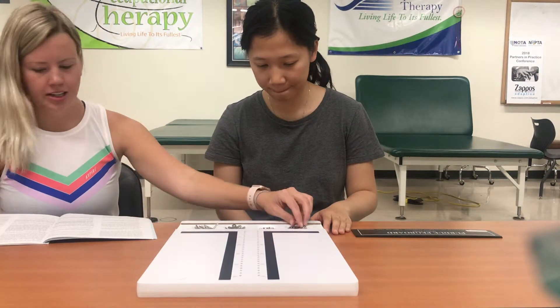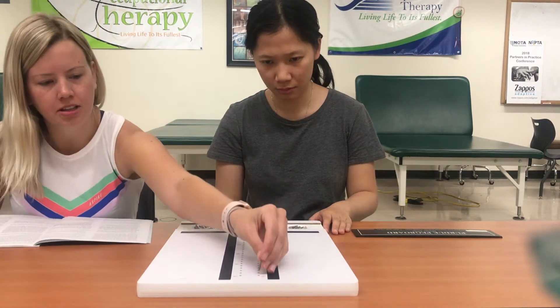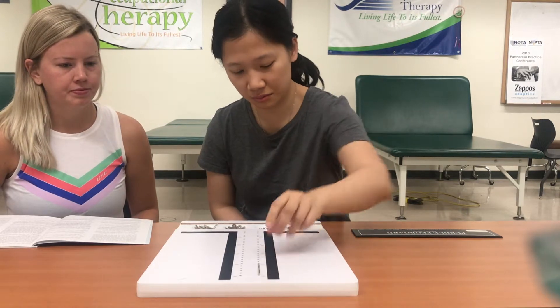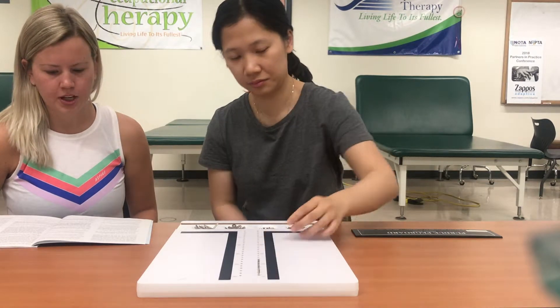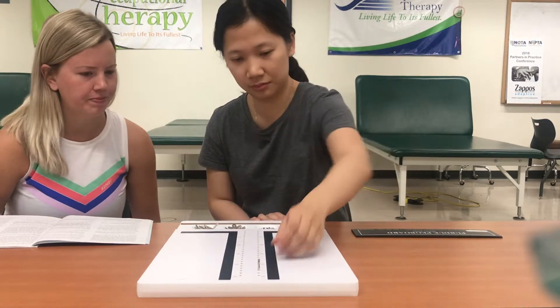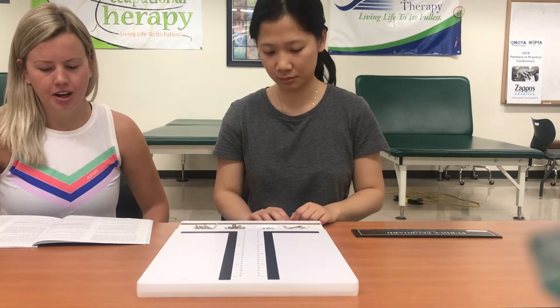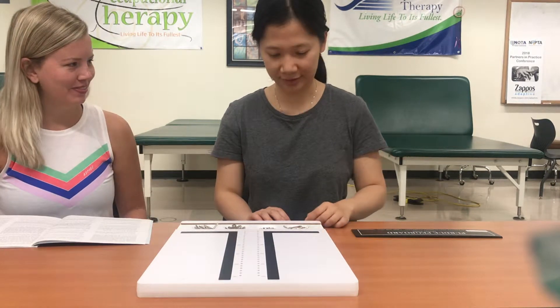With your left hand, pick up one pin at a time from the left-handed cup. Place each pin in the left-handed row, starting with the top hole. You may insert a few pins for practice. Take out the practice pins and put them back in the left-handed cup. When I say begin, place as many pins as you can in the left-handed row. Starting with the top hole, work as rapidly as you can until I say stop. Are you ready? Begin.